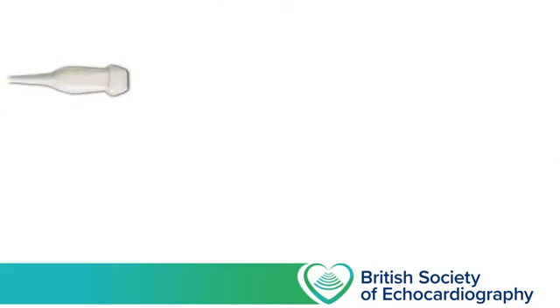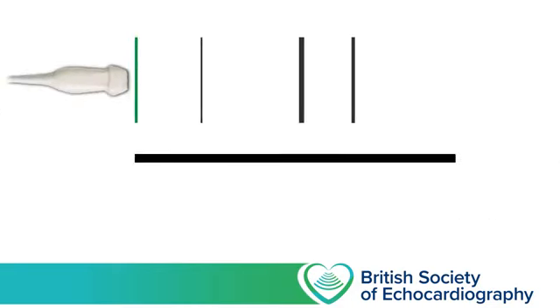So we've said that it's the returning wave that allows us to generate an ultrasound image. This is because the piezoelectric effect can work in reverse. Applying kinetic energy to the array of crystals generates a charge that travels back into the ultrasound machine and can be interpreted by the ultrasound software. So what information does the ultrasound software record? Well, it measures the amplitude of a returning wave, how much energy returns, and it also measures the amount of time it took for the energy to return following the transmission of the original wave.